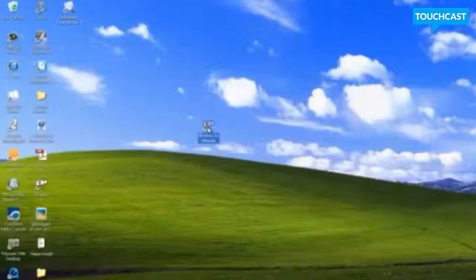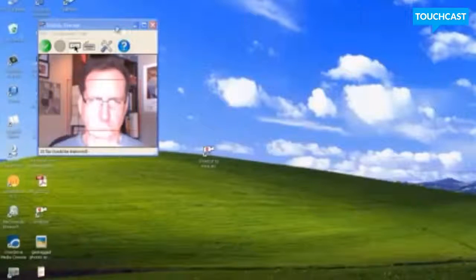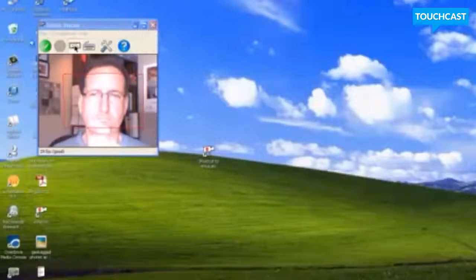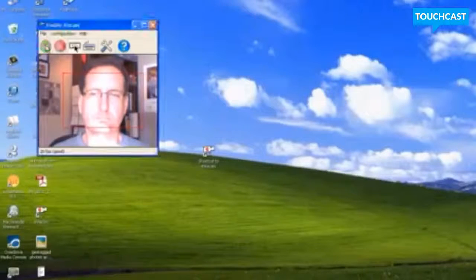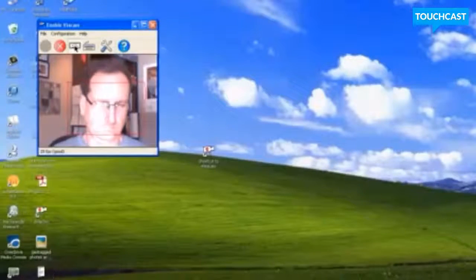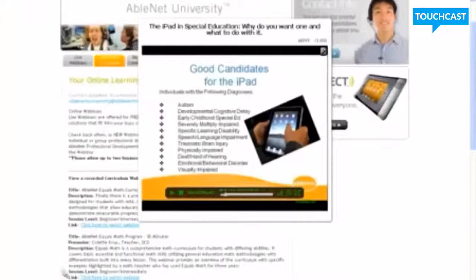Hello, this is Rick Weinberg and I'm using eViacam to control my computer. I downloaded the software from SourceForge.net and you can see right now that the red rectangle has kind of locked on to my eyes and nose. And I'm now controlling the mouse with my head movements.